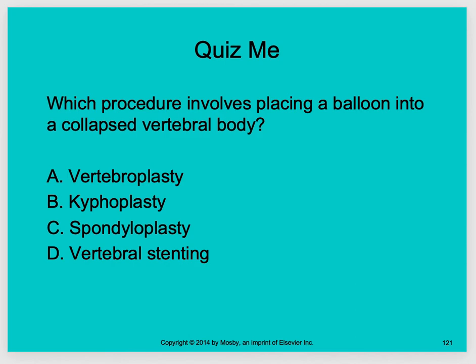So which procedure involves placing a balloon into a collapsed vertebral body? So this is that balloon into that vertebral body. Vertebroplasty, kyphoplasty, spondyloplasty, or vertebral stenting. And we know that that is kyphoplasty.